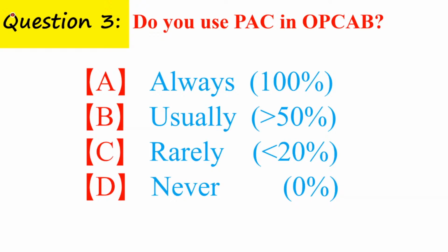Okay. In my hospital, most of the off-pump CABG is performed by minimally invasive approach. So in that case, if there are more than three branches or 3 bridges, we will use the PAC. Otherwise, we only use TEE. For the traditional surgeries, from my experience, I always use PAC in that kind of surgery. So it's different. Thank you.